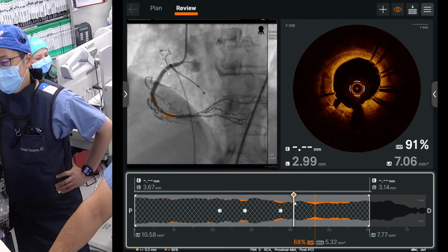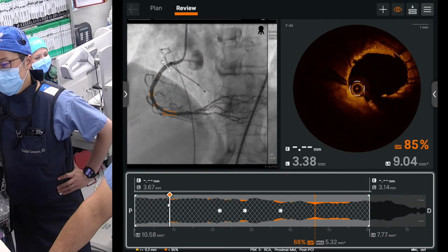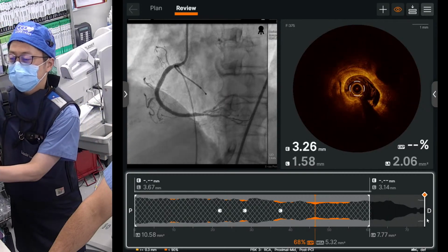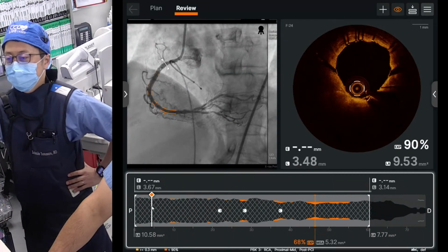And the proximal edge you could not see? No. That's surprising because actually the 78 millimeters was reached. Yes, because we have extra native vessel, like 20, we went a little bit distal to get the distal edge. Do you want me to do the proximal or leave it?